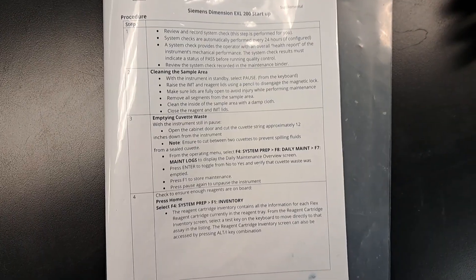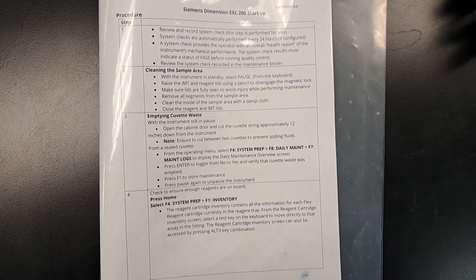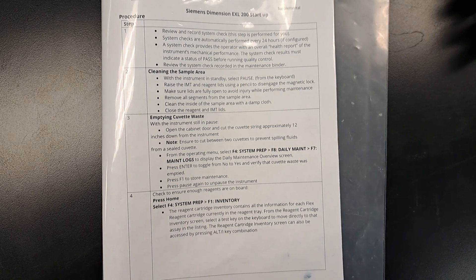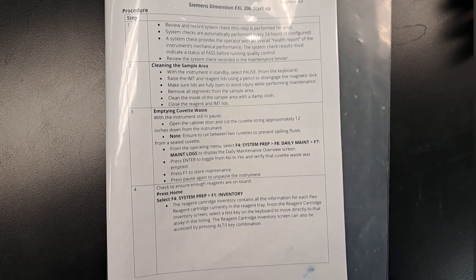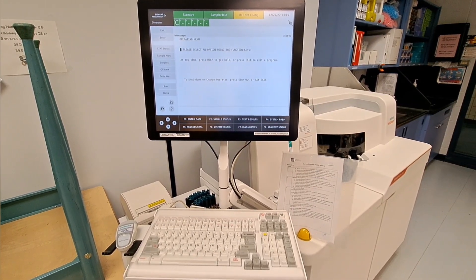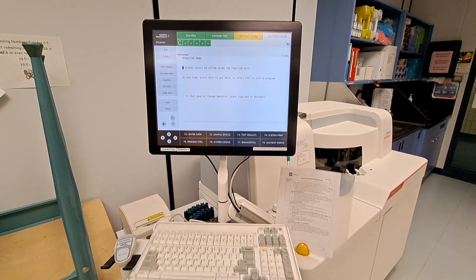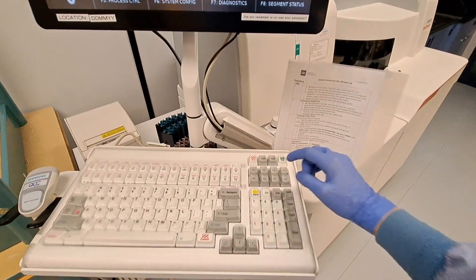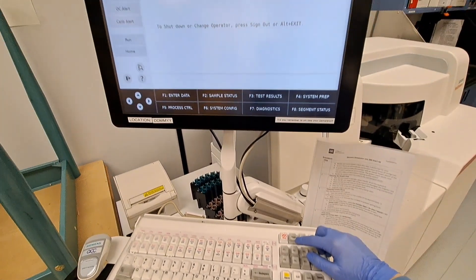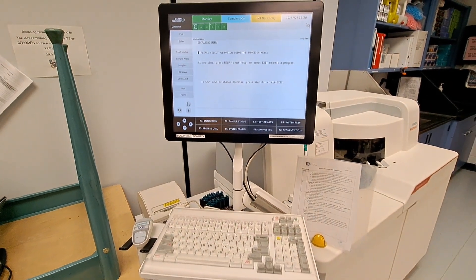Let's get started on our daily maintenance. The system check should already be performed for you by the prep techs, and you'll have a printout to show the students or to review for yourself. So let's go ahead and clean the sample area, empty the cuvette waste, and make sure our inventory is up to par for today's run. For the purpose of safety, our analyzer's maintenance is performed while the analyzer is in standby. You can see the status of the analyzer on the top left of the monitor. To pause the analyzer, we'll hit pause on the keyboard. Hitting pause turns the samplers off, and there will be no risk of injury during our maintenance.